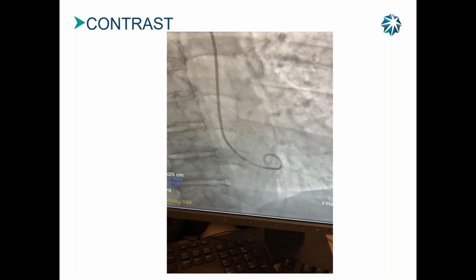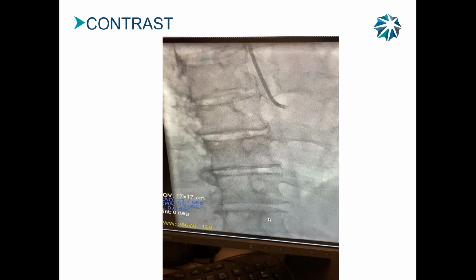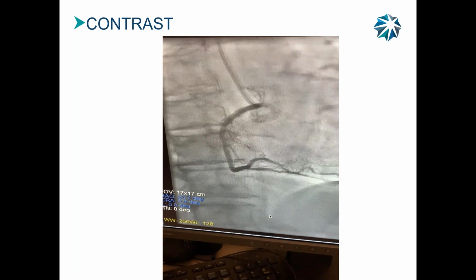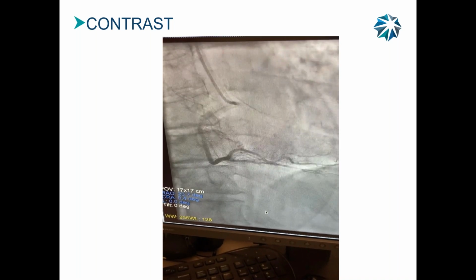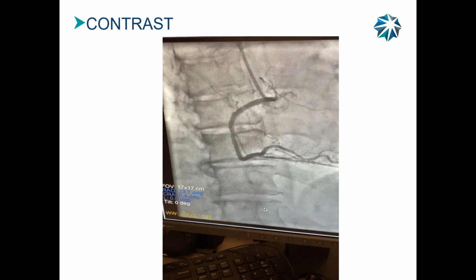You see how before you don't see that, how it shades up in here and you can't see anything here? You can't see any blood vessels or anything, right? Now you do. That's what contrast does. But why is it dark here and not white?